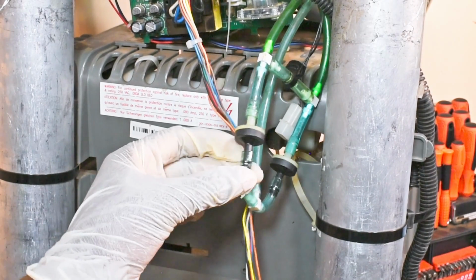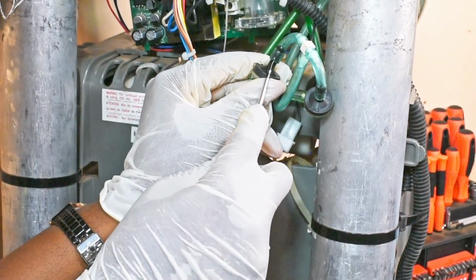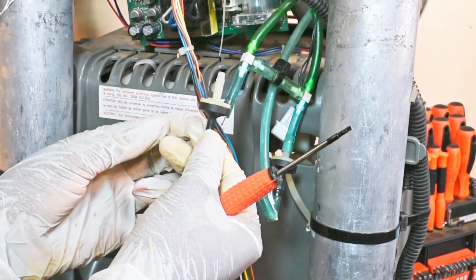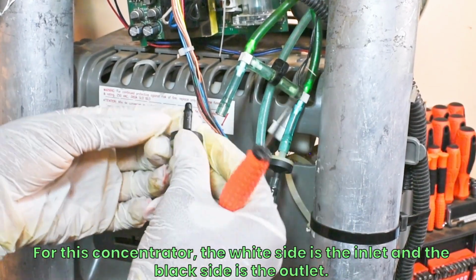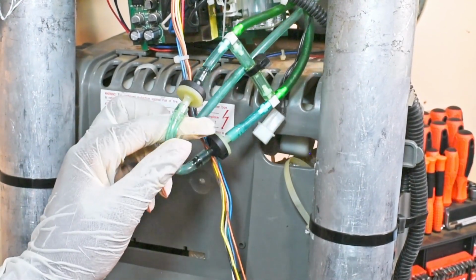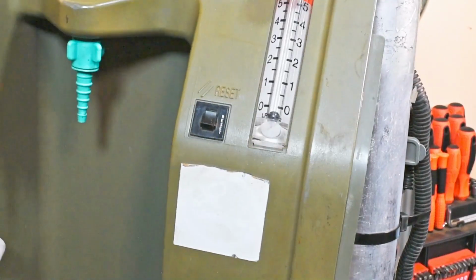Now, I will reverse the direction of this check valve. It is important to use a flathead screwdriver. So earlier the direction was this way, and now I'm going to reverse it. After doing this, we are going to test the oxygen purity. So I'll do the same procedure, turning on the concentrator and measuring it using an oxygen analyzer.